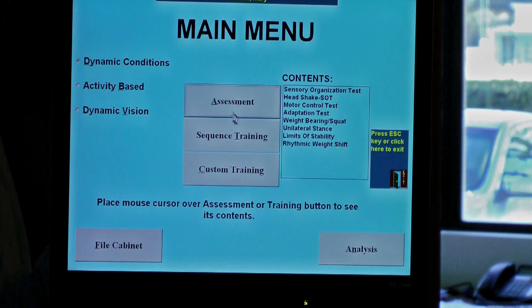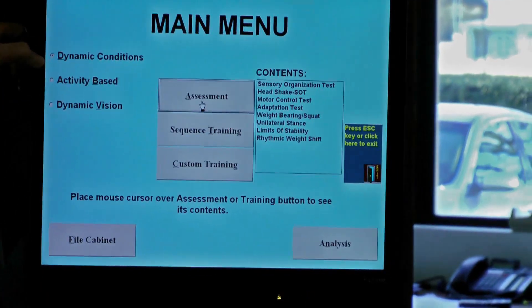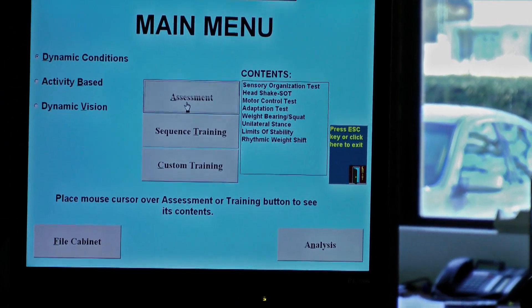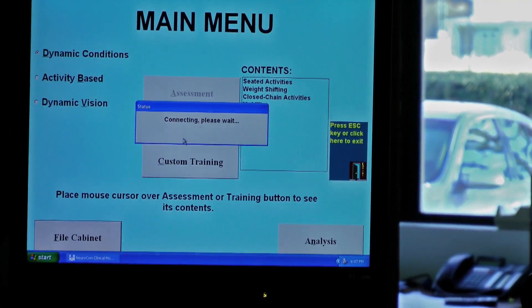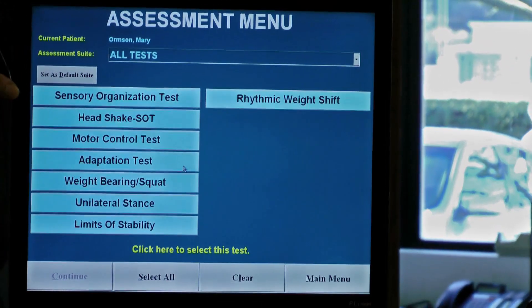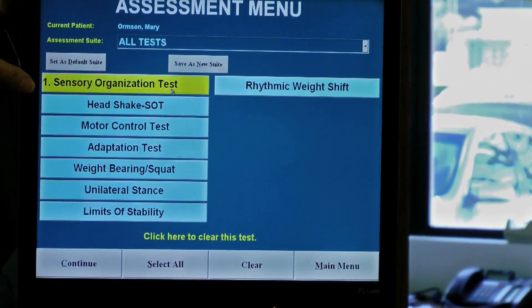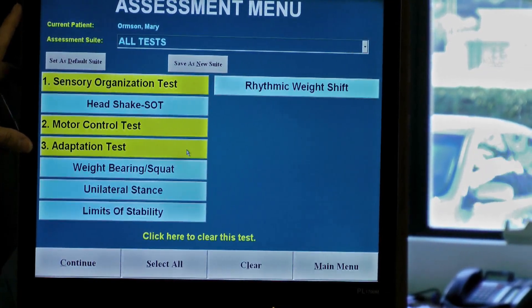We're going to choose the tests she's going to perform today from the main menu. I'm choosing Dynamic Conditions, choosing Assessment, which brings me into my test menu. Of the assessments available in my dynamic system, I'm going to choose the Sensory Organization Test, the Motor Control Test, and the Adaptation Test in that order.